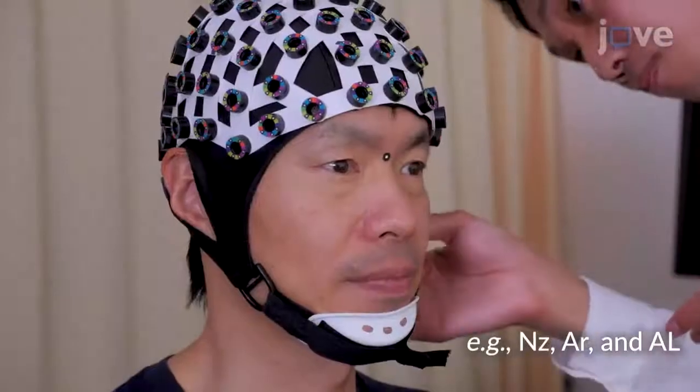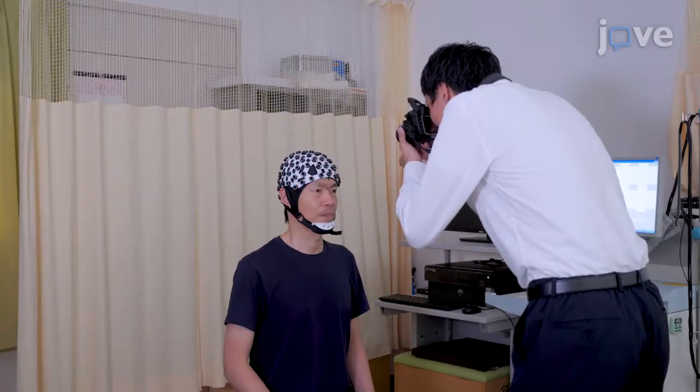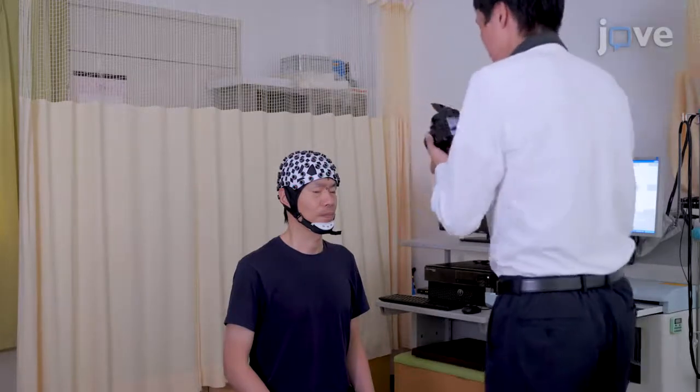Attach the marking sticker to reference location points and take pictures of the subject's head with the probe locations, including the reference points from 15 perspectives.